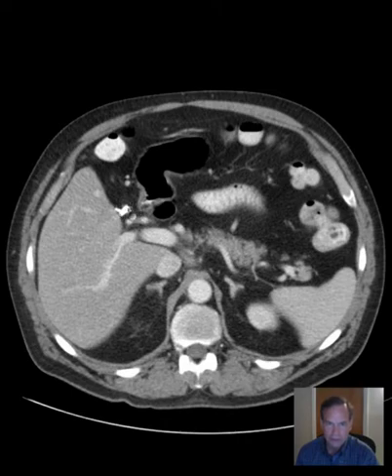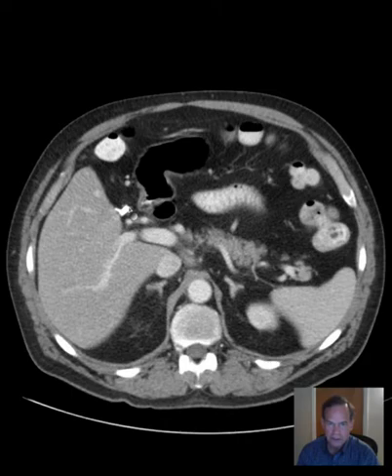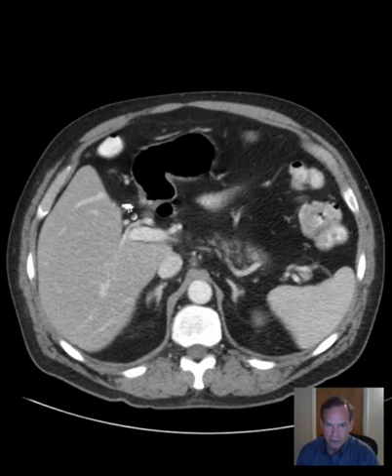The gallbladder is surgically absent. The patient has had a cholecystectomy. We see surgical clips in the anticipated position of the gallbladder, so the gallbladder has been removed.